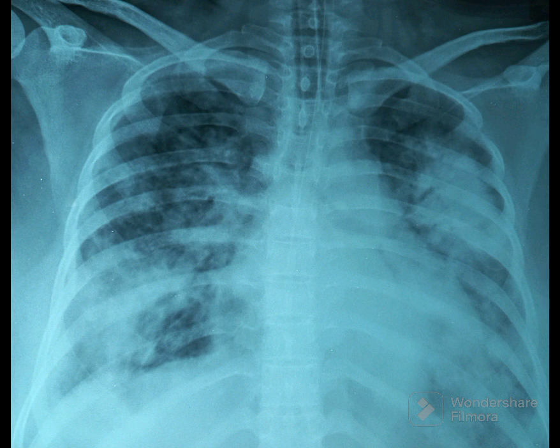This chest x-ray shows bilateral consolidation. Dense consolidation is noted in the entire left lung except the apical area, and in the right lower zone.